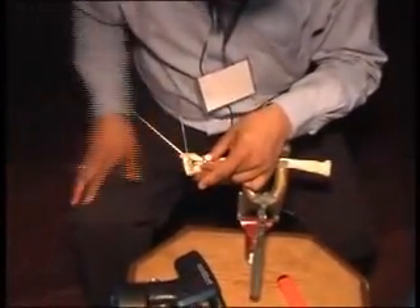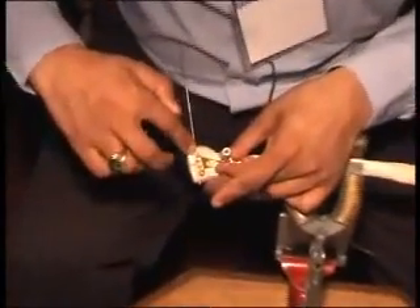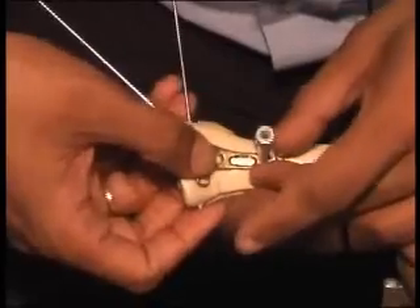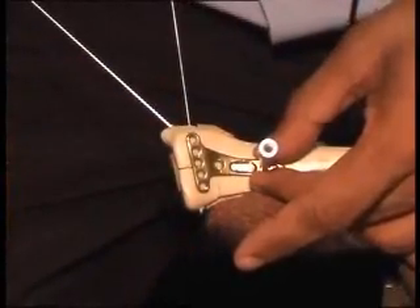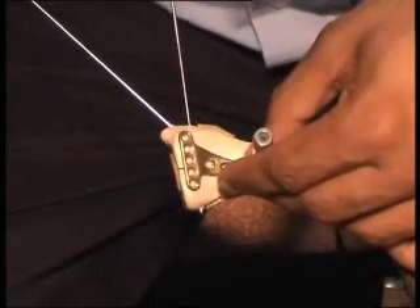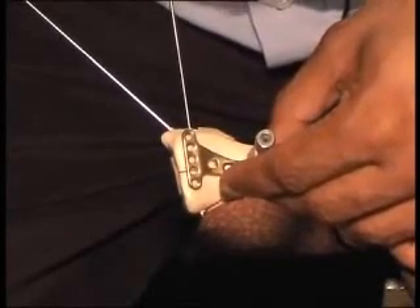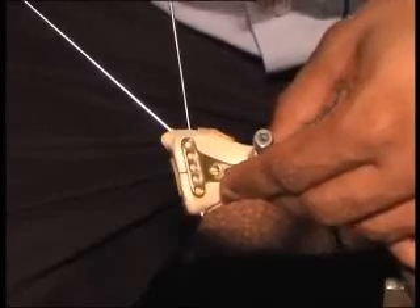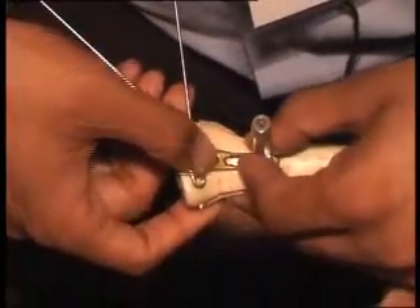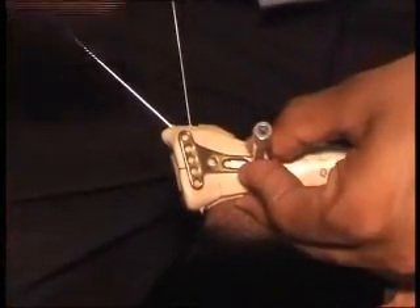There are two types of plate — one for left and one for right. The distal end of the plate should be pointing towards the radial styloid. Whenever there is comminution, the only bone we get is subarticular bone, so our plate has to be as distal as possible. However, the screws should not go into the articular surface — that is the key consideration, and that is why we have an oblong hole.